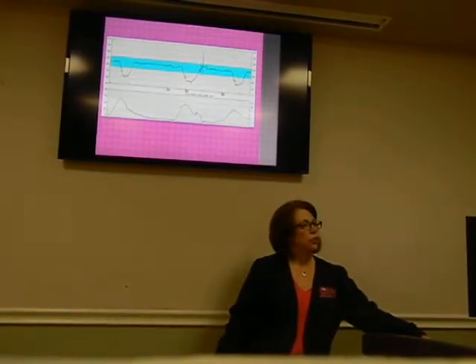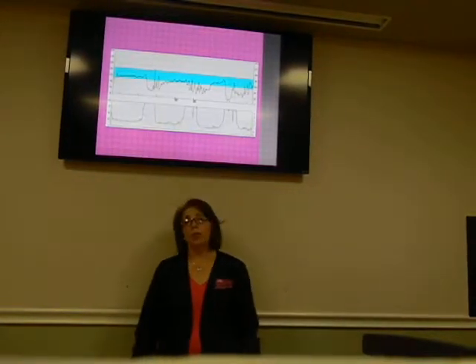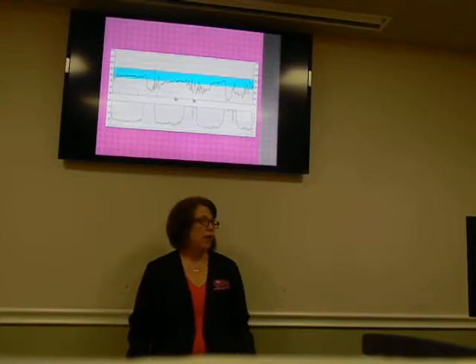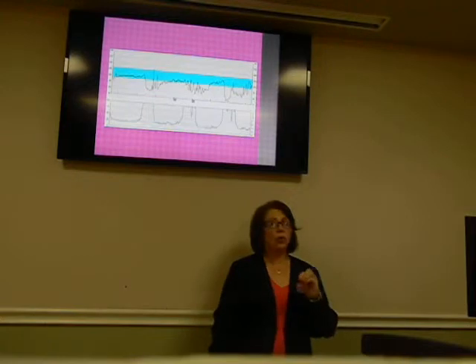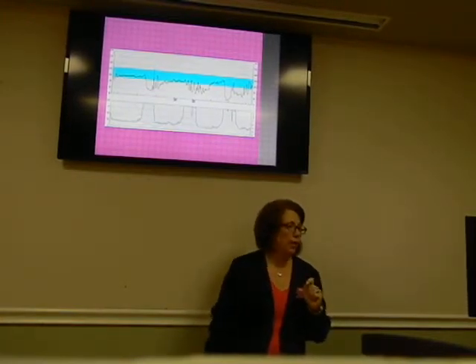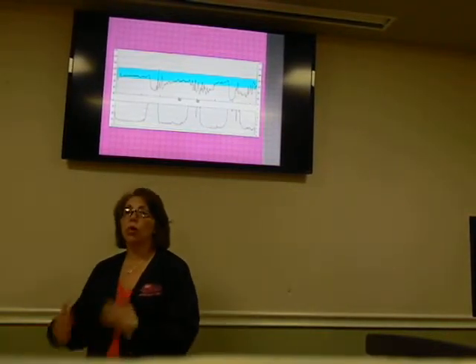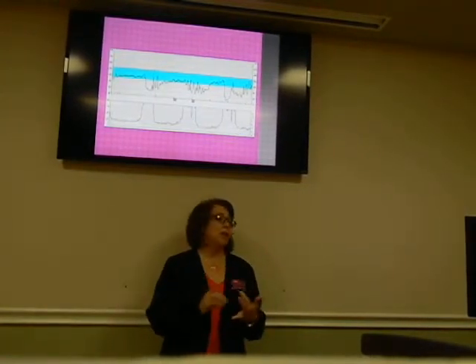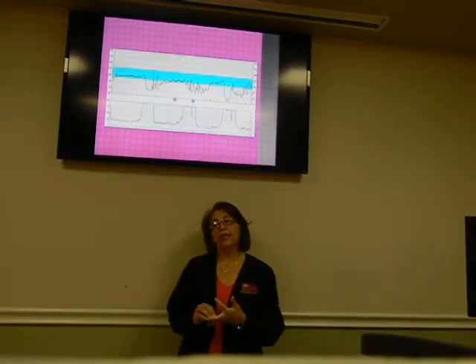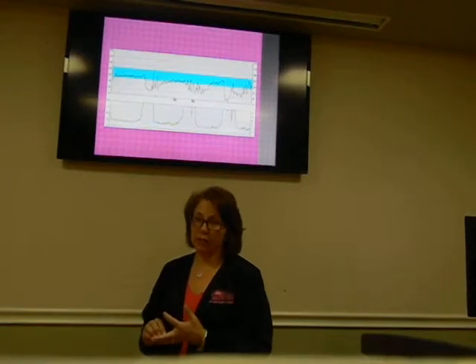So if you see a fetal heart rate tracing that looks like this, then you may really want to show some concern because it has decels, or the dips below, which are called decelerations, way below the baseline fetal heart rate. The nurses or medical professionals may start to work with the patient at that time, providing oxygen for the mother and baby, providing IV fluids, or possibly even talking to the patient about surgical delivery of the baby called a C-section.